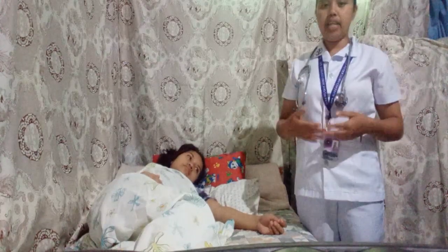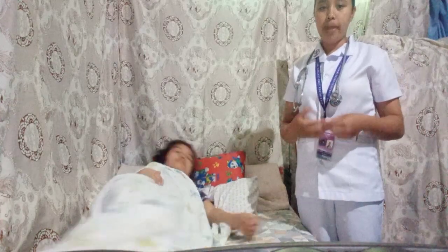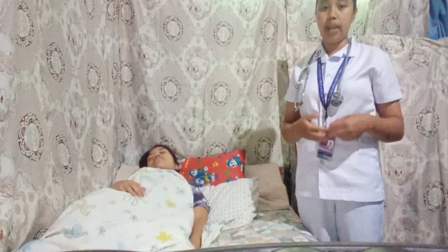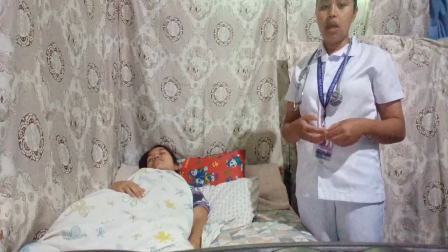Assess for the heart rate and rhythm by placing the diaphragm of the stethoscope at the apex and listening closely to the rate and rhythm of the apical impulse. Counted the heartbeat for a full minute. If an irregular rhythm was detected, assess for a pulse rate deficit, using the diaphragm of the stethoscope first, then the bell.